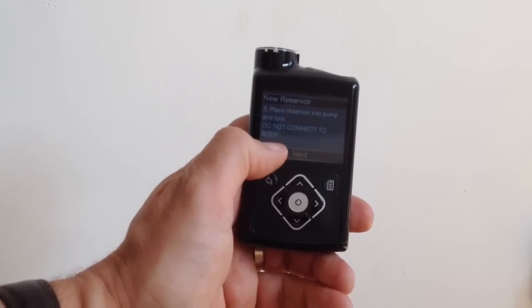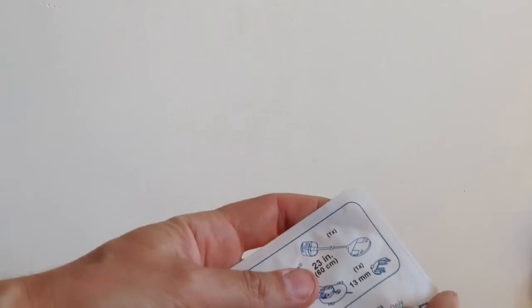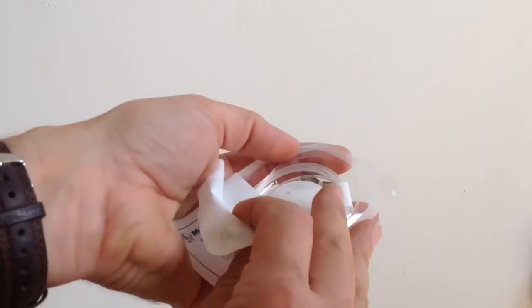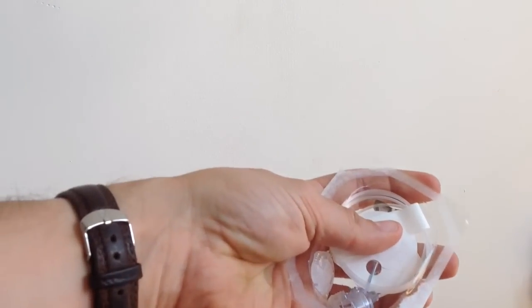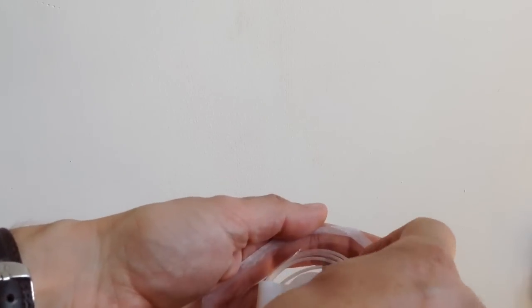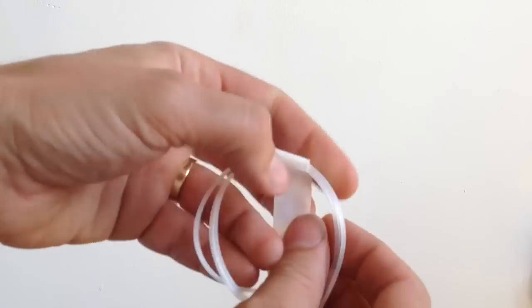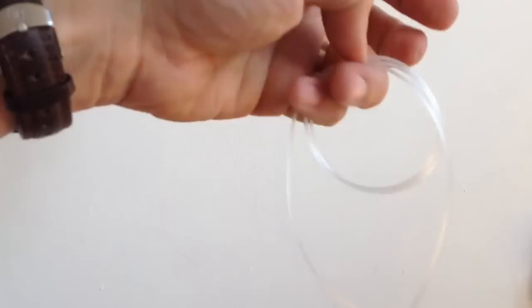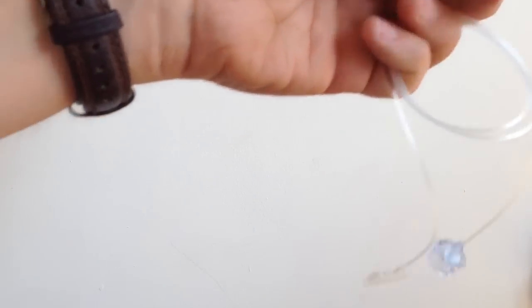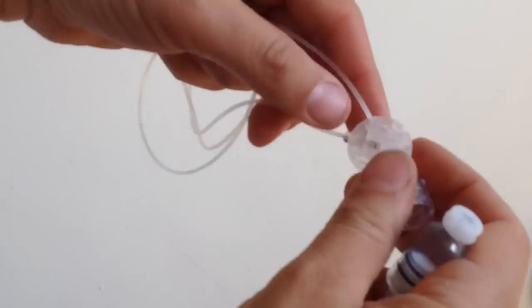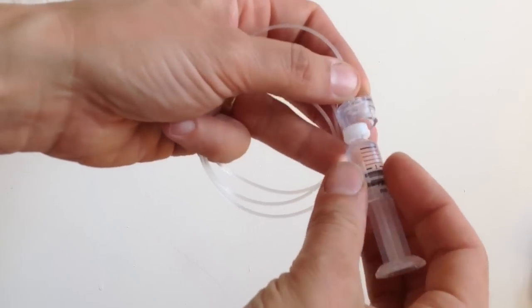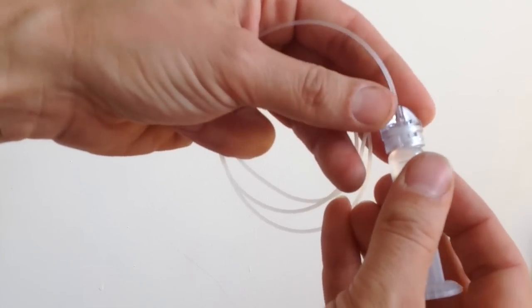Next, you place the reservoir into the pump and lock, but you don't connect anything to the body. So, of course, now, I need to have my infusion set open. Like that. And I'll just get the tubing out. Like that. Put that to one side.